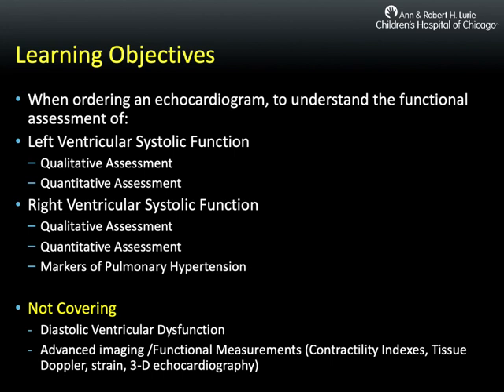For the scope of this talk, we will not be covering diastolic ventricular dysfunction, as well as some of the other advanced imaging and functional measurements, such as contractility indexes, tissue Doppler, strain and speckle tracking echocardiography, as well as 3D echocardiography.